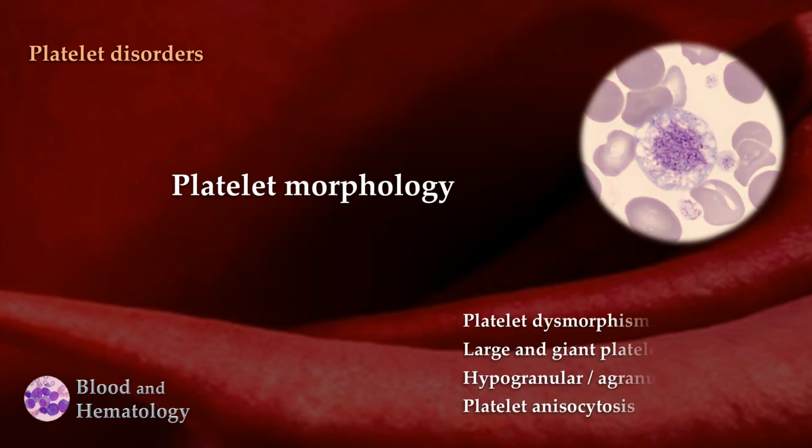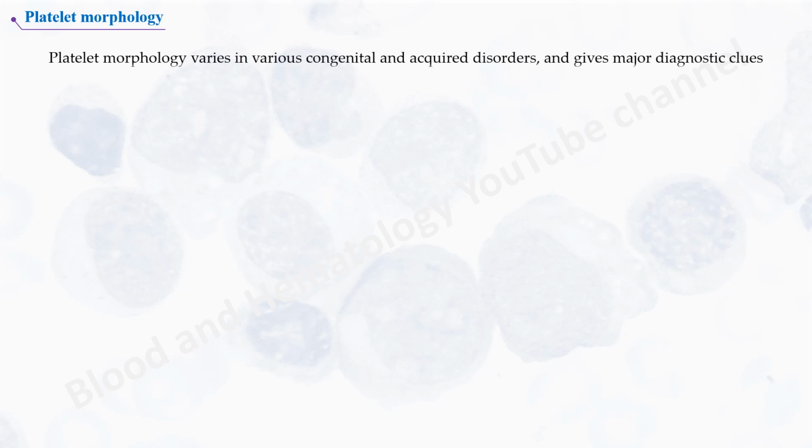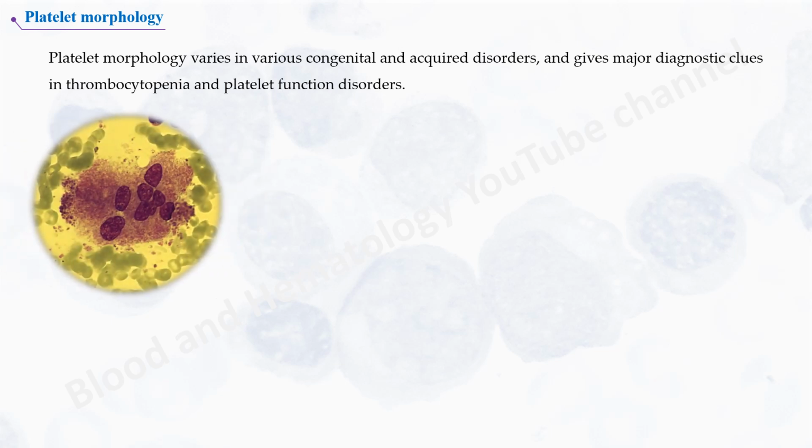Normal and abnormal morphology of platelets are discussed in this video. Platelet morphology varies in various congenital and acquired disorders, and gives major diagnostic clues in thrombocytopenia and platelet function disorders.